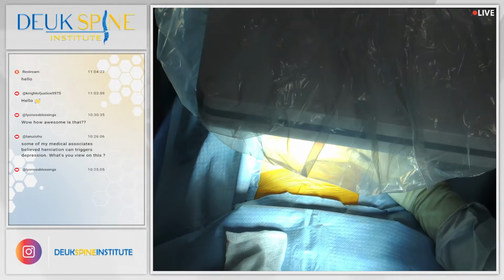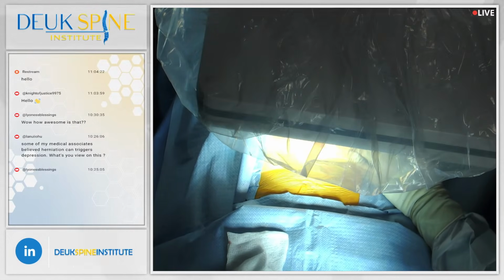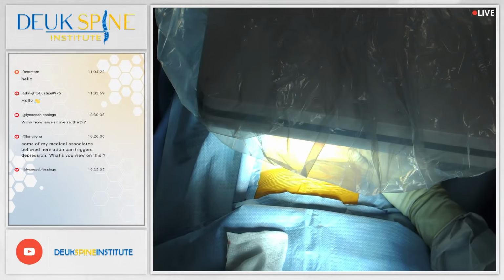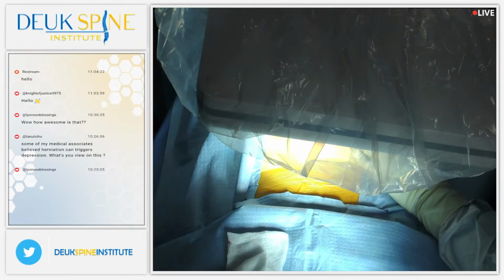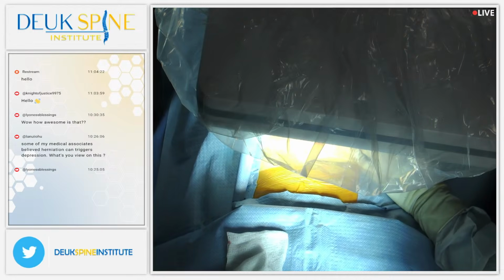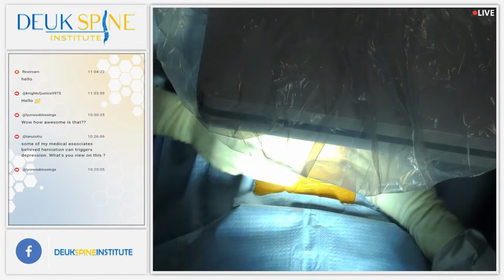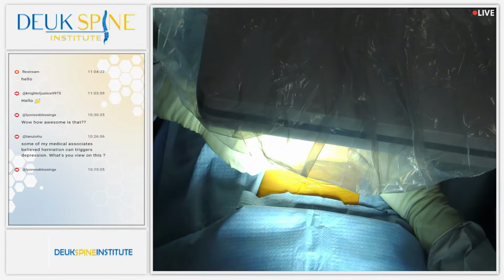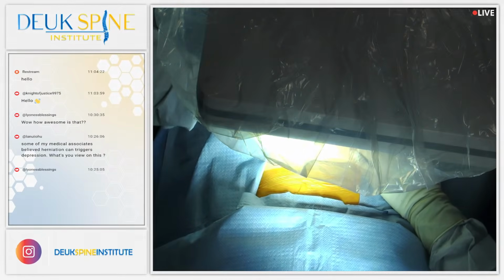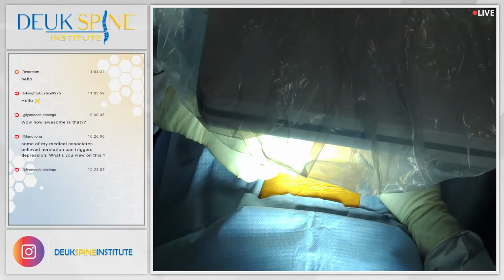All right, welcome back. You've just watched how we treat facet joints that are painful, and now I want to show you how we treat sacroiliac joints that are painful. Let's show the audience how an SI joint gets injured and becomes painful through the process of arthritis. And then we're going to show you how we use our Deuk plasma wand to go into that joint and destroy the pain nerves that are causing people's back pain in the joint.